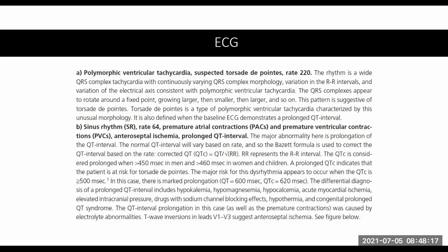So that's a lot of information to take in. All right. Basically, we're going to look at what a Torsades is supposed to look like. Okay. Because you must never forget this. This is the type of thing that you may see once every 2 years, once every 3 years. But it's so easy to sort out. And when you see it, you'll be the hero when you sort it out.